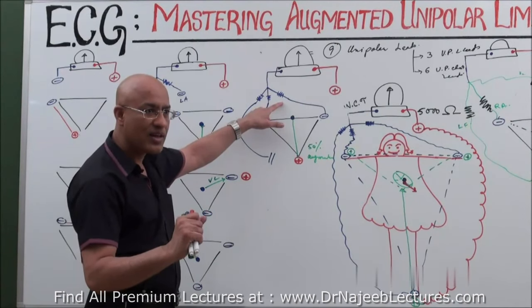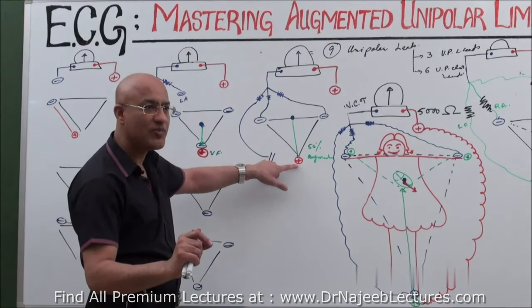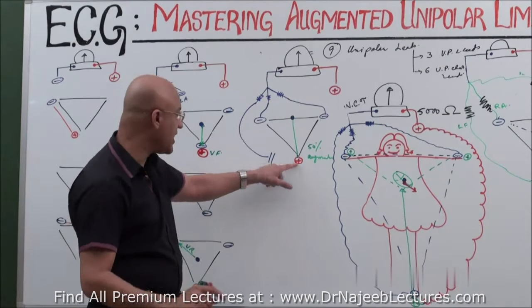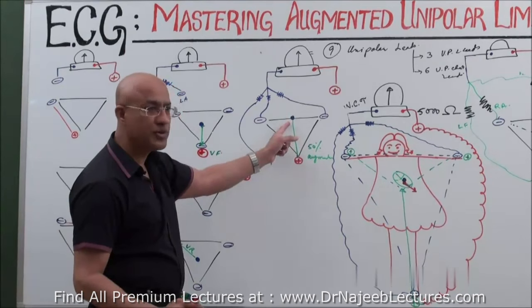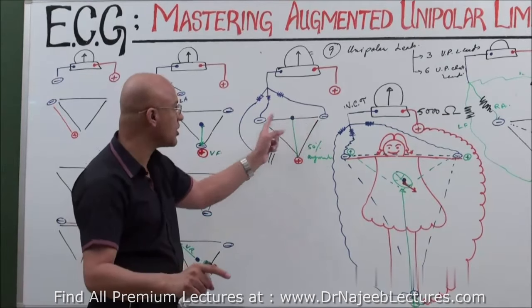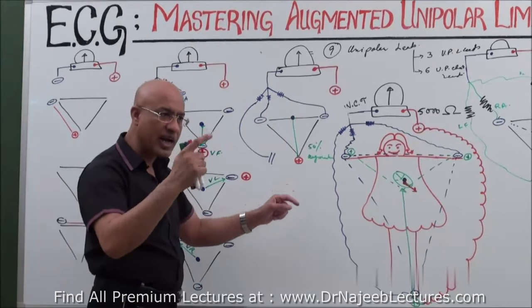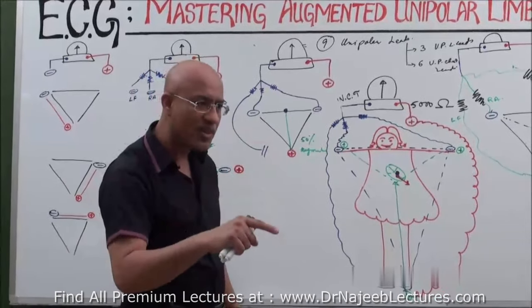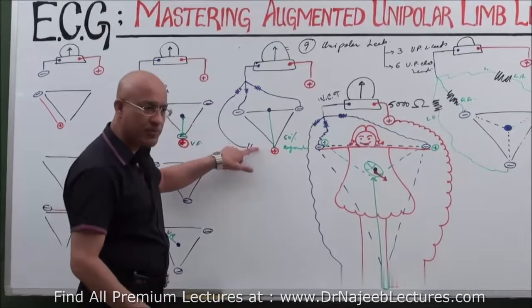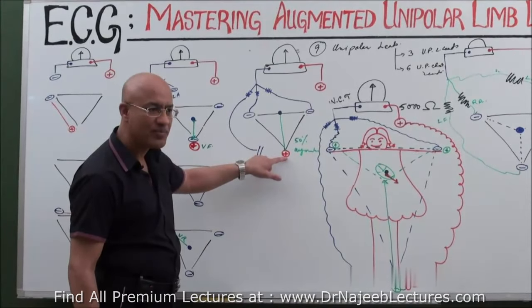What was the specialty of Goldberger central terminal? That wherever he put the exploring electrode, associated negative electrode was inactivated or disconnected. In this way, now a new virtual electrode was generated. Your indifferent electrode was generated, which was in between the two negative. But voltage is increased and waveform amplitude is increased 50%. You are understanding or not? Because when you remove negative from here, this negative is unable to neutralize some of the potential here.